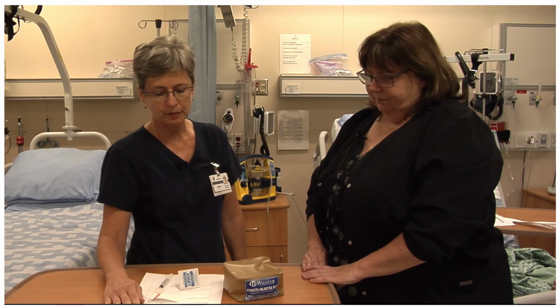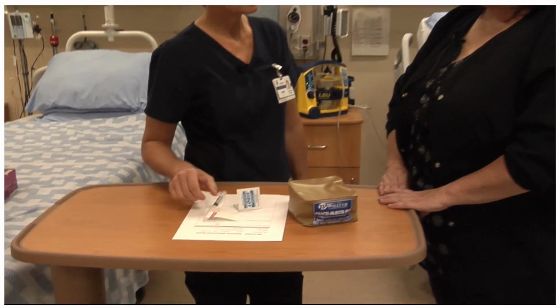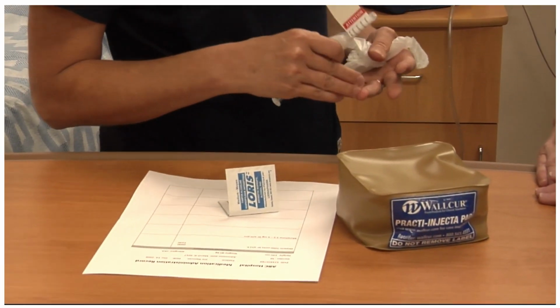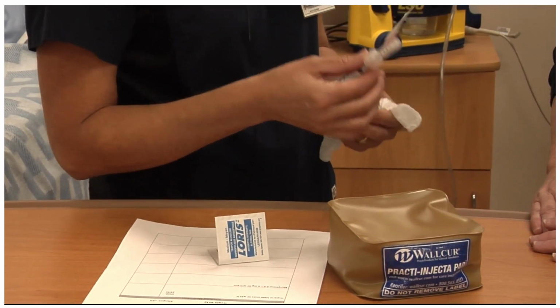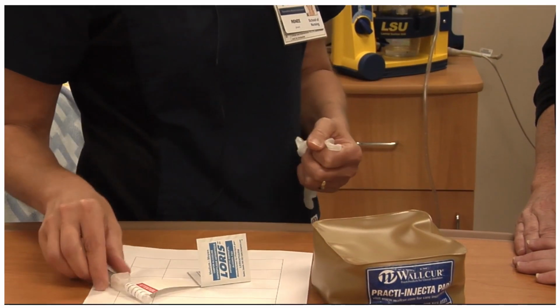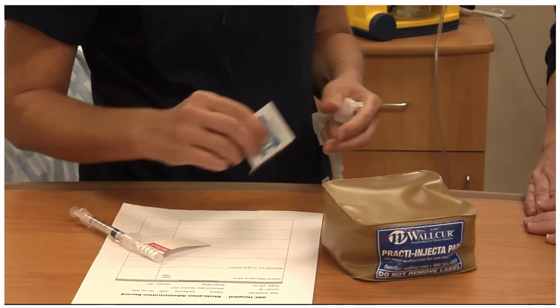Correct. So I've prepared my medication. I've brought my MAR to the bedside. My syringe should always be labeled: two patient identifiers plus the drug and the dose and the date and the time and who prepared it, because you want to make sure when you get to the bedside that what you're going to put into the patient is indeed what you prepared. So I've asked my patient for two identifiers and they've confirmed that.